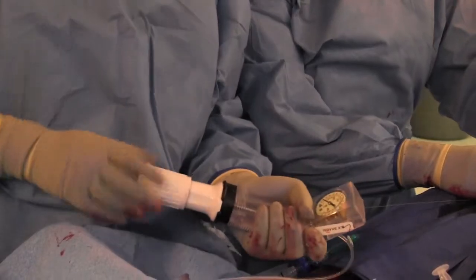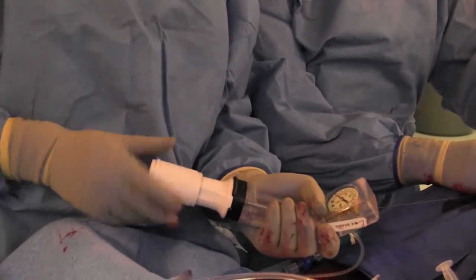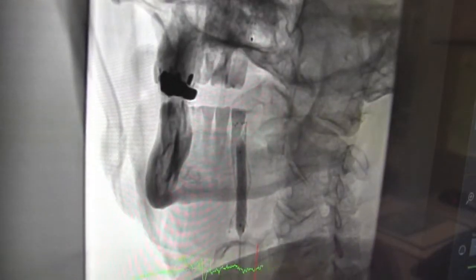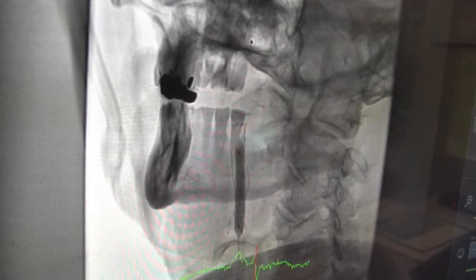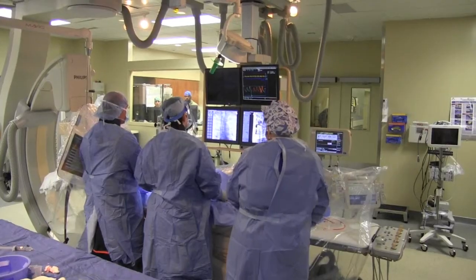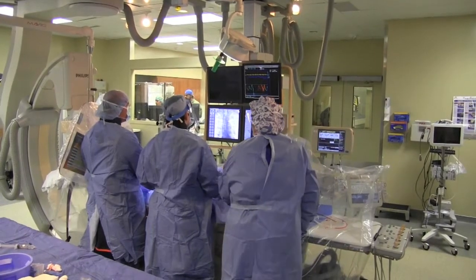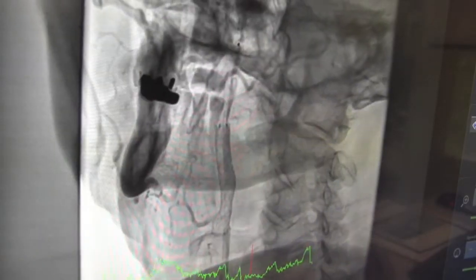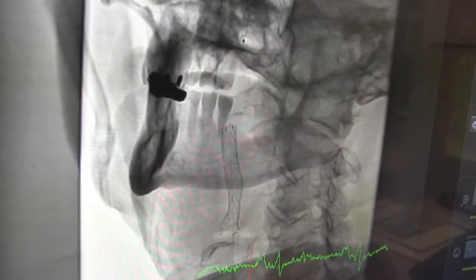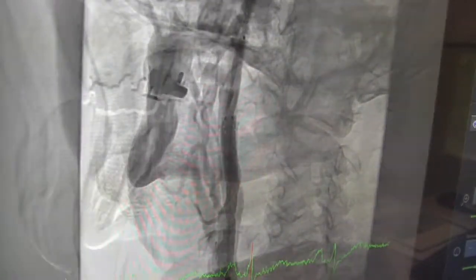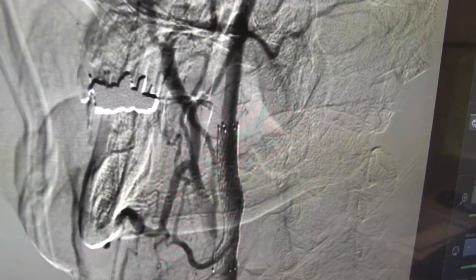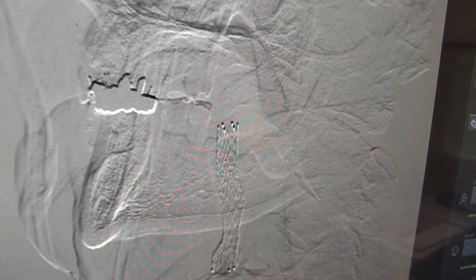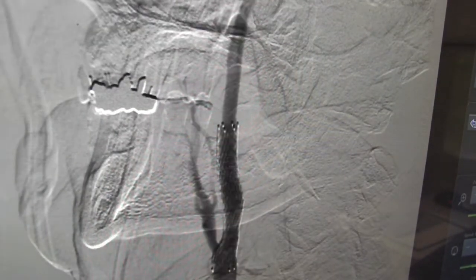We're post-dilating the stented area with the balloon to make sure the stent is well expanded everywhere it needs to be. We then take a final angiogram to confirm everything looks good, and we're very happy with the final result. The subtracted angiogram makes everything much easier to visualize, and here we see an excellent result with our stent procedure.